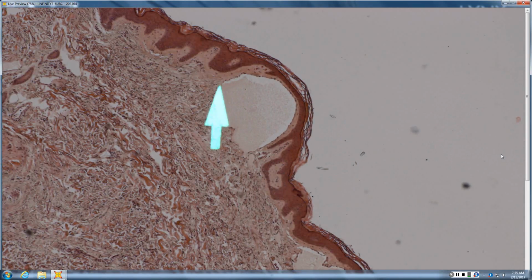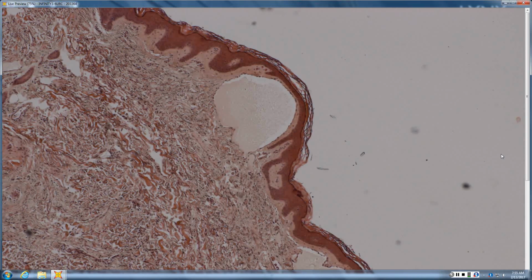So, like a lymphangioma circumscriptum, like a microcystic lymphatic malformation. Yeah, so lymphangioma, and the endothelium does not appear particularly hobnail. If it did, you might look deeper to see if there were THH underneath. This one is just lymphangioma and not particularly hobnail endothelium.